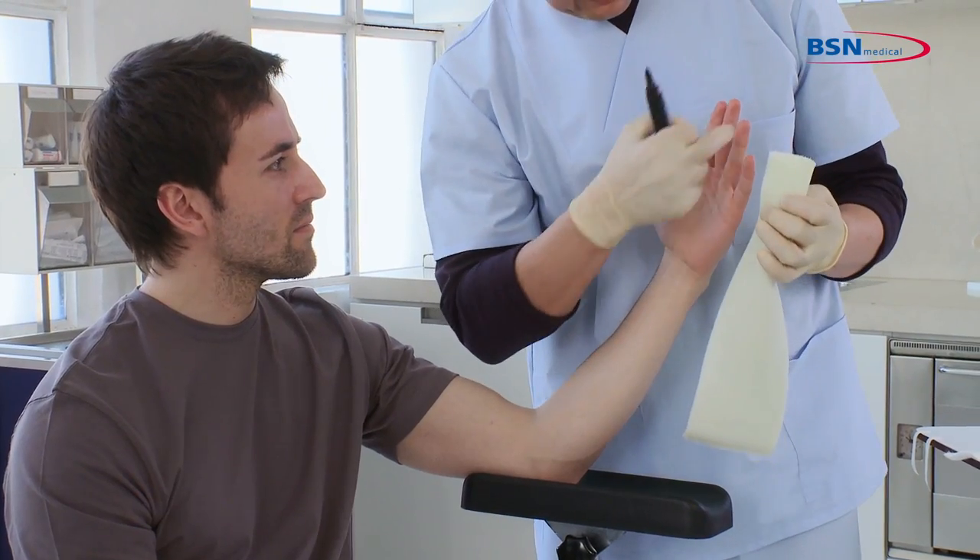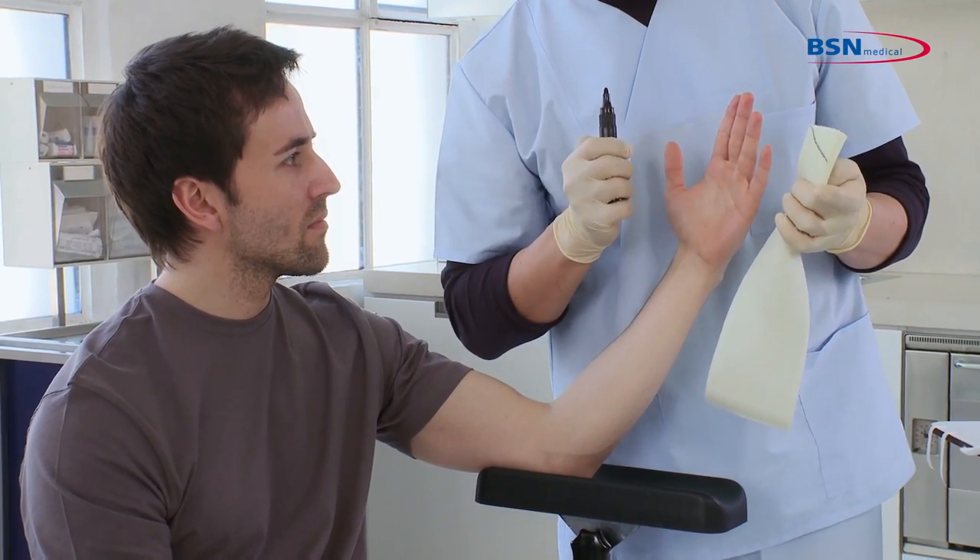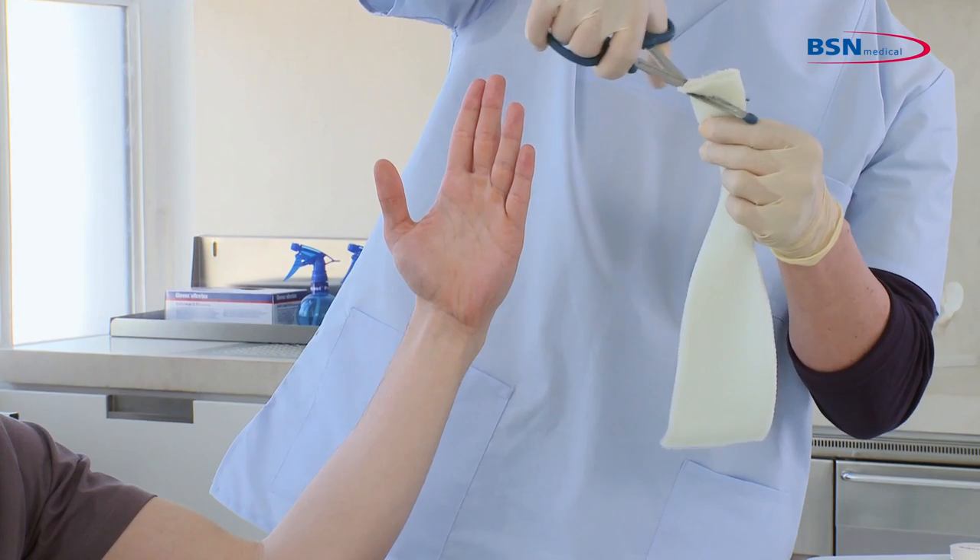Fold the substrate lengthwise and mark a line on the substrate following the patient's fingertip angle. Round the edges.